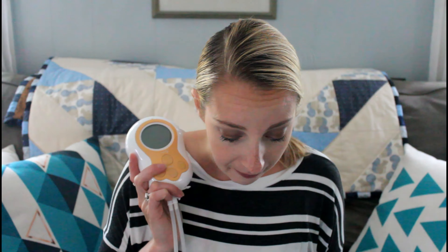It comes with a little bag, which is cute. The bag's not the best quality — not like the Medela bags — but it's still pretty decent. I'm actually using it as a diaper bag because it's smaller. It has a rechargeable battery which is nice, and I love how portable it is. The company website is really nice and well done — if you're confused about something and need to go there for information, it's really easy to understand.